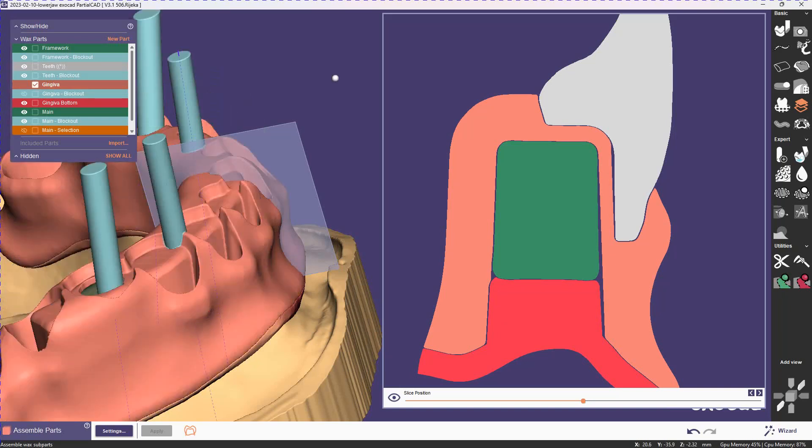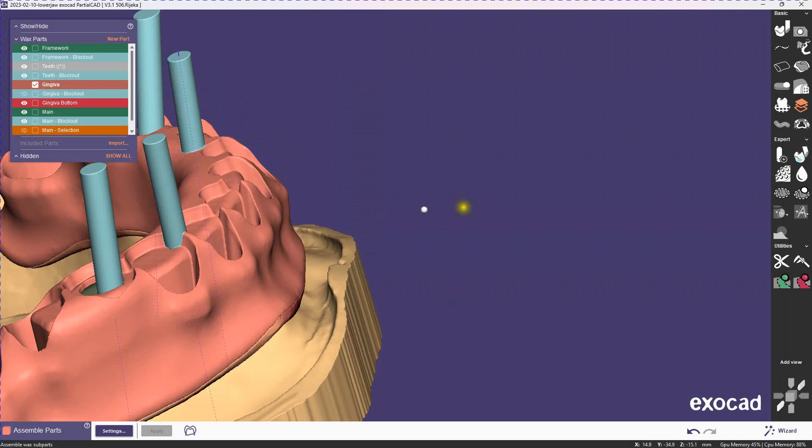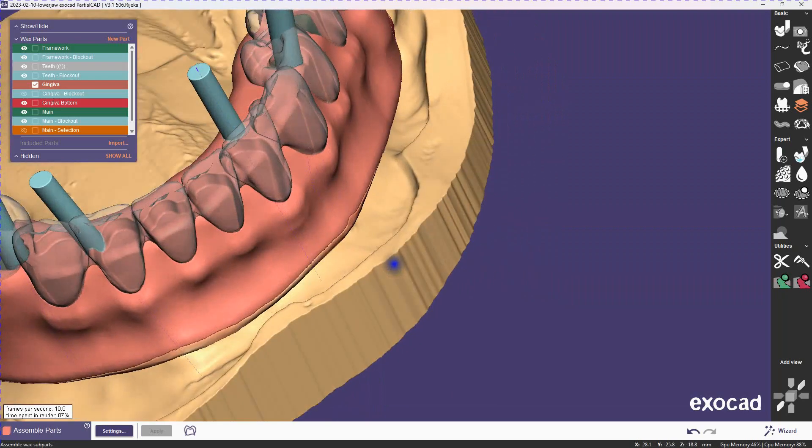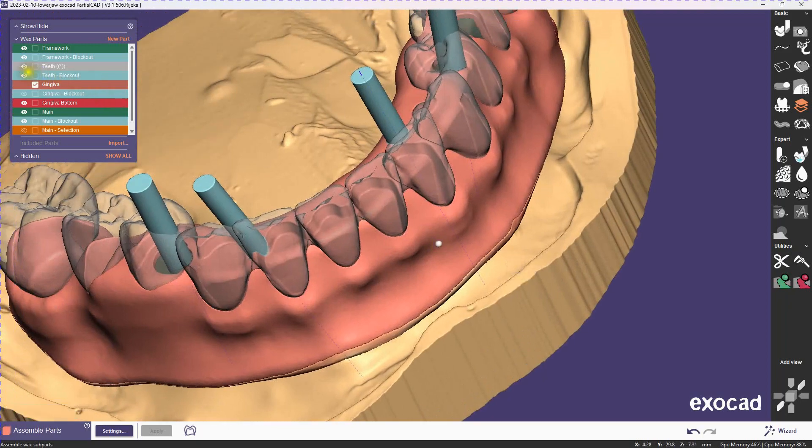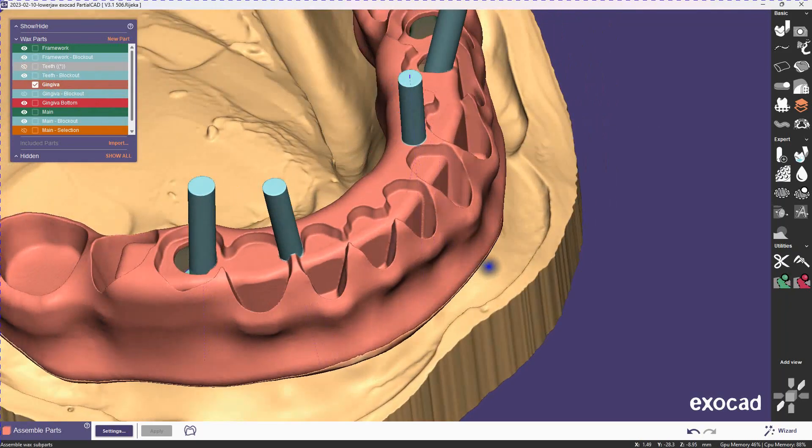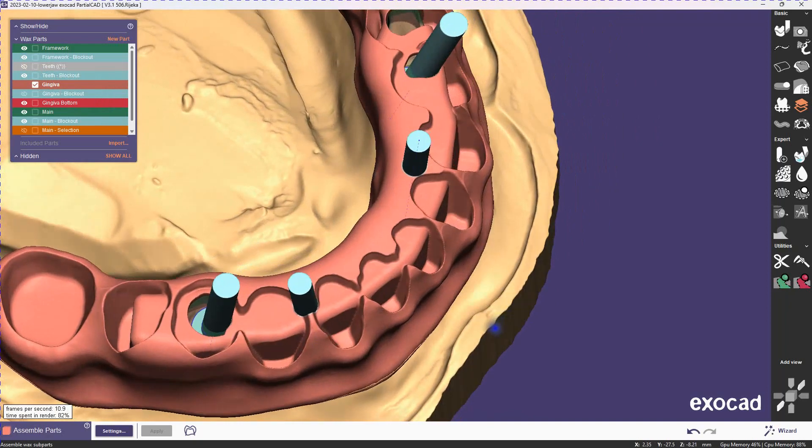Let's take a look at the gingiva here. So you can see how it made the tooth pockets, and that it's still covering the bar.